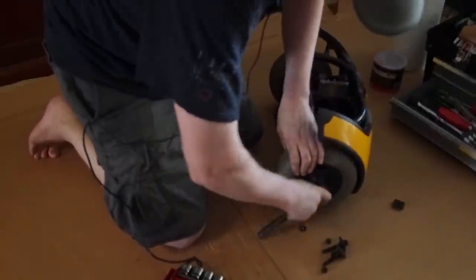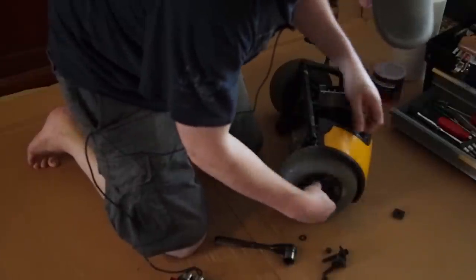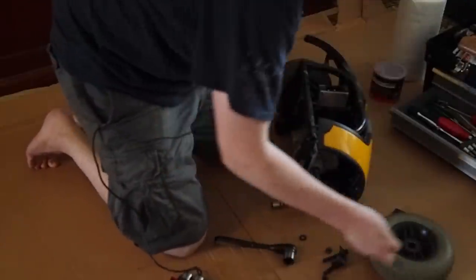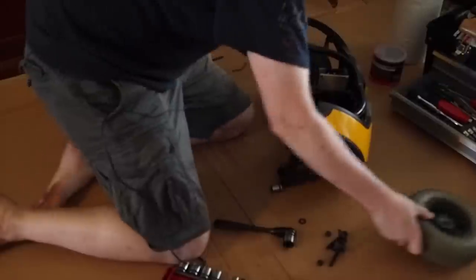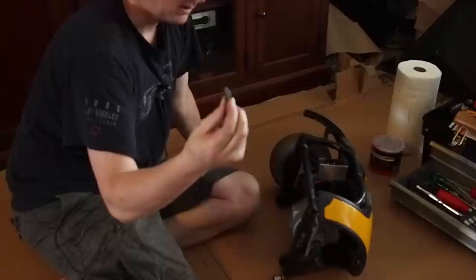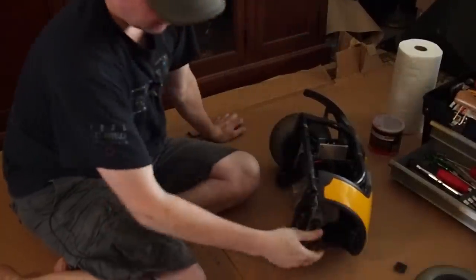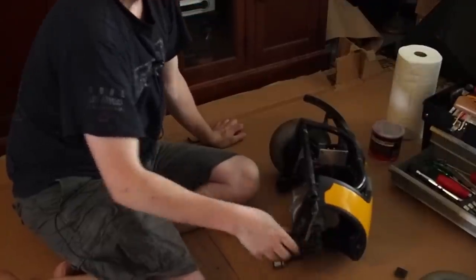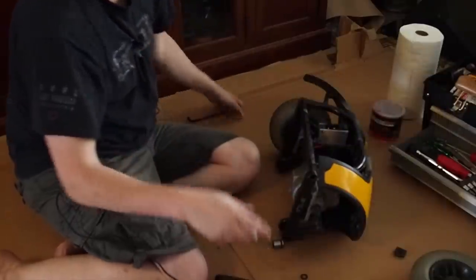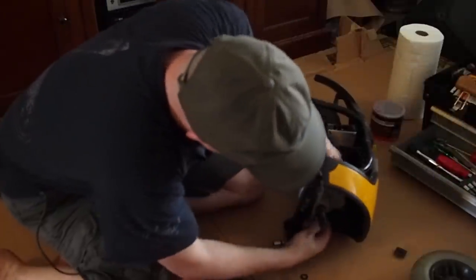Here I'm taking off the wheel. I'm only taking off one wheel. The truth is that the other wheel doesn't want to come off, so I'm not going to bother with it. Again, I kind of just put the bolts in there. The wheel has a little slug, and this is to keep the wheel from turning. I keep that with the wheel as well, so I don't lose it. So this whole thing is going to go out this way once I take off the clutch arm, and that's just two little screws. I've undone the bolts for the most part.